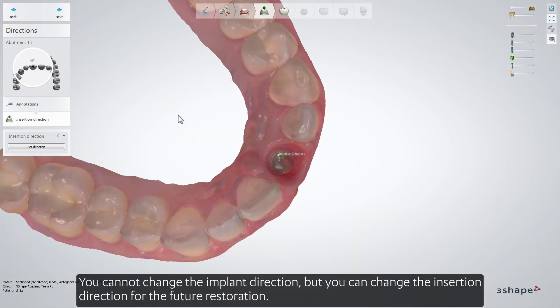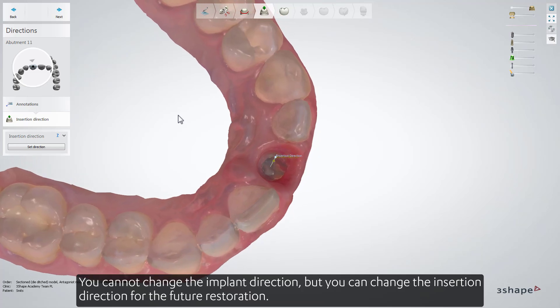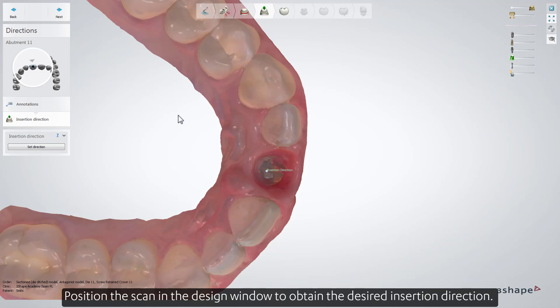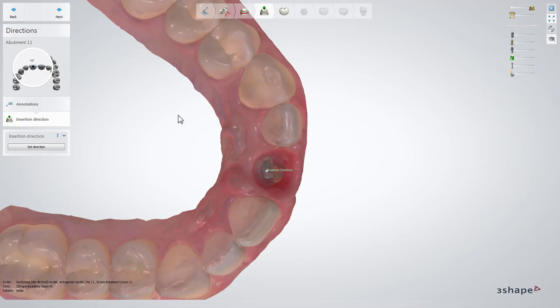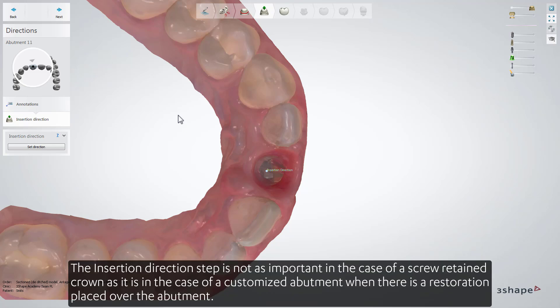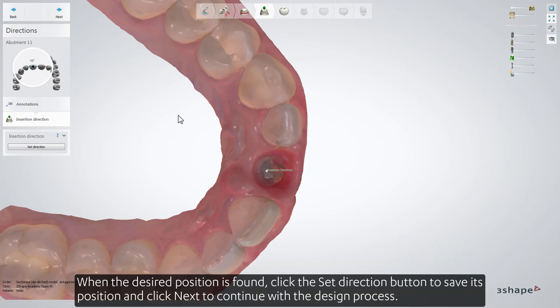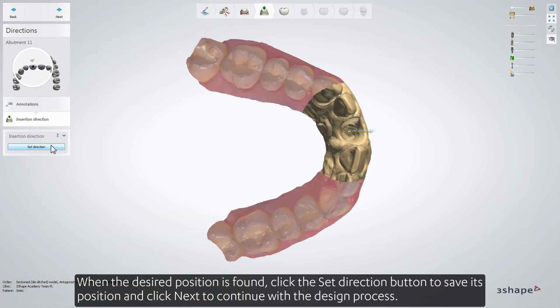You cannot change the implant direction, but you can change the insertion direction for the future restoration. Position the scan in the design window to obtain the desired insertion direction. The insertion direction step is not as important in the case of a screw retain crown as it is in the case of a customized abutment, when there is a restoration placed over the abutment. When the desired position is found, click the Set Direction button to save its position, and click Next to continue with the design process.